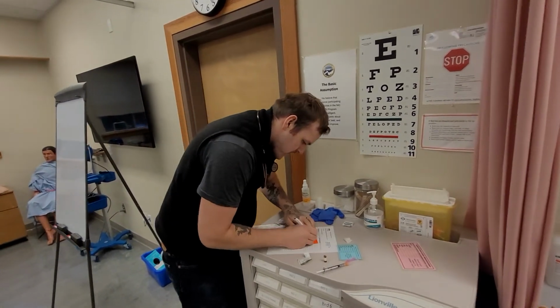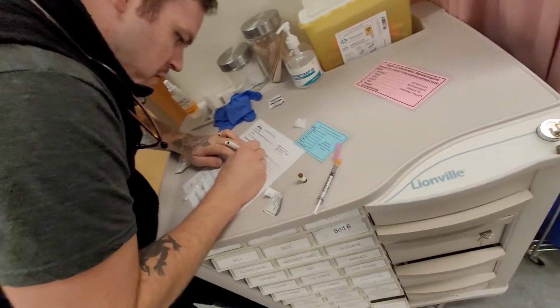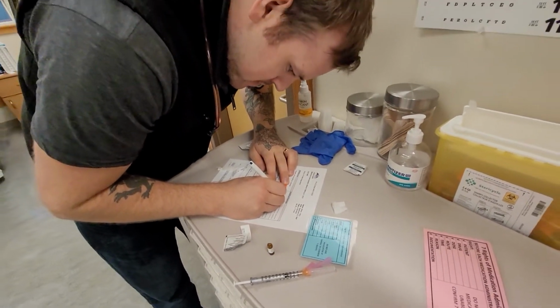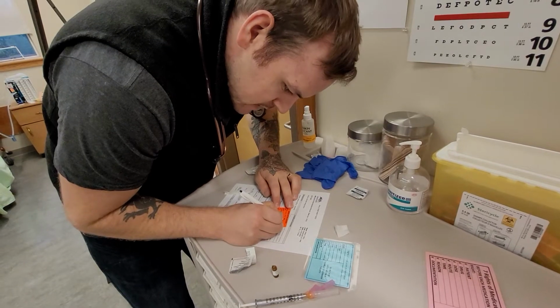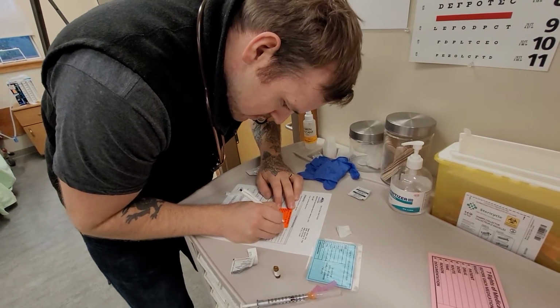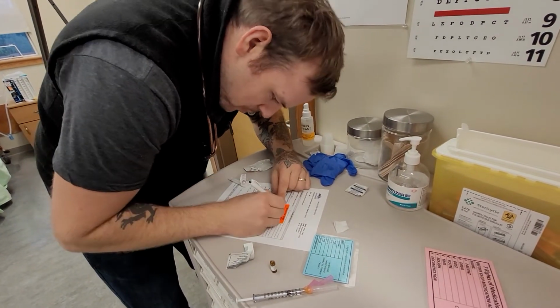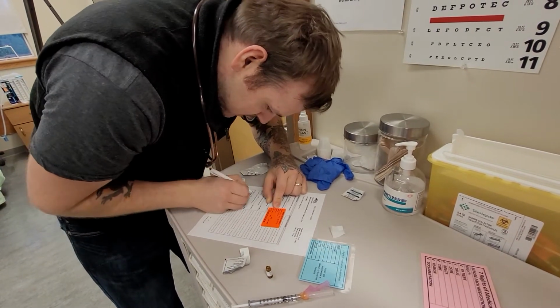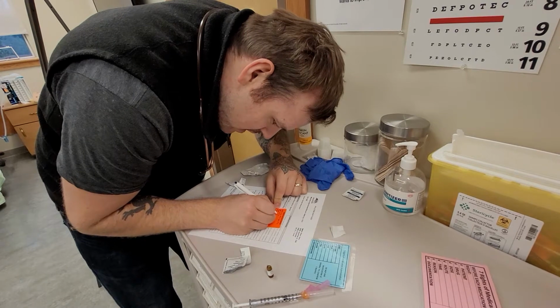So we're just working our way through. We've got Wilson, Harry. Room, he is in room 302. Drug, this is morphine. Amount, 2.5 milligrams.